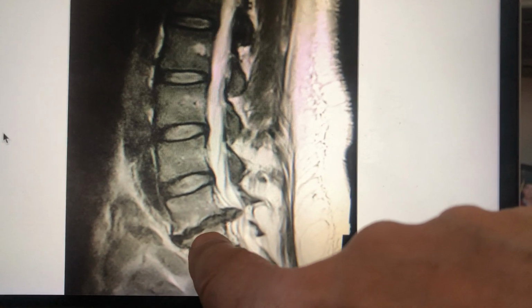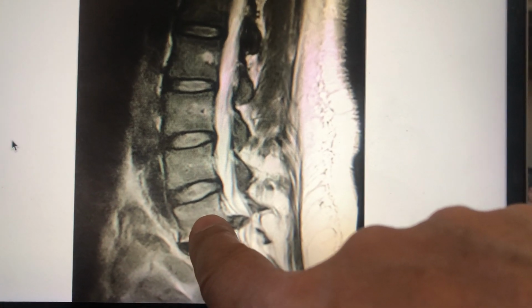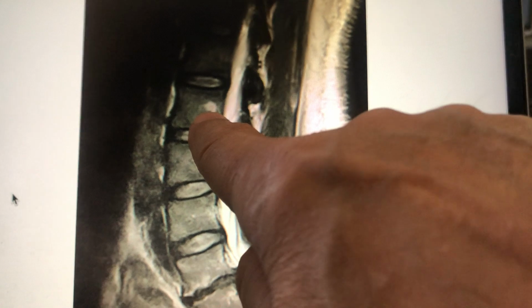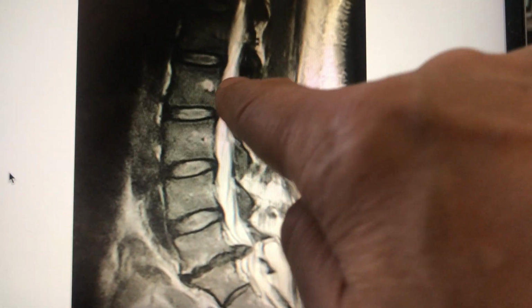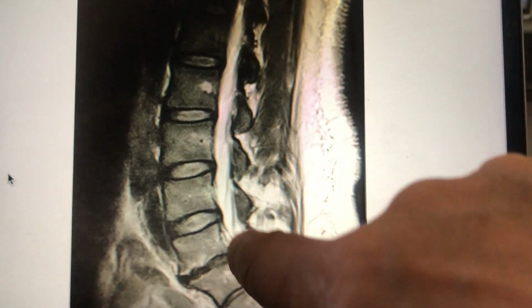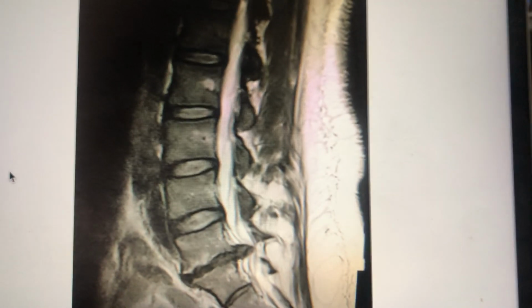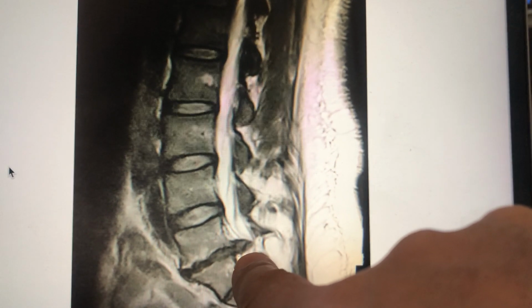So this is S1. The vertebra above that is L5, the 5th lumbar vertebra. This would be L4, that's L3, that's L2, that's L1 up there. So coming back down here, you can see the canal back here, which is where all the nerves are, and the white cerebrospinal fluid and connective tissue there. That all looks normal with the exception of this disc right there, which is sticking out.